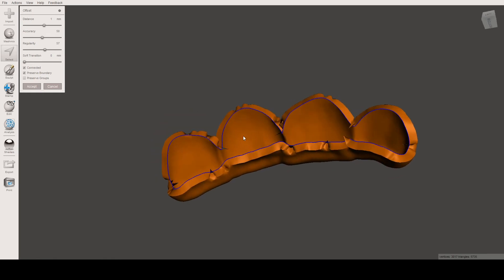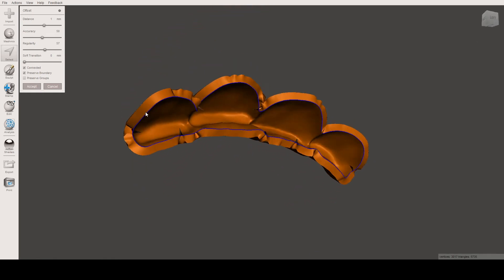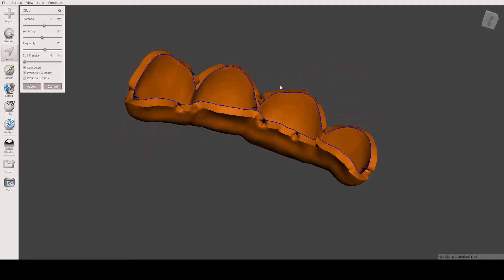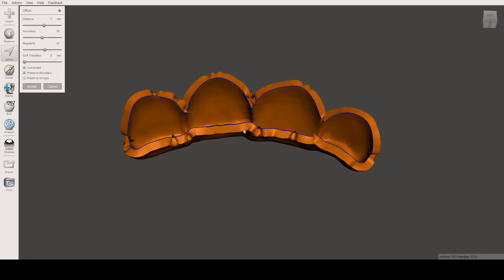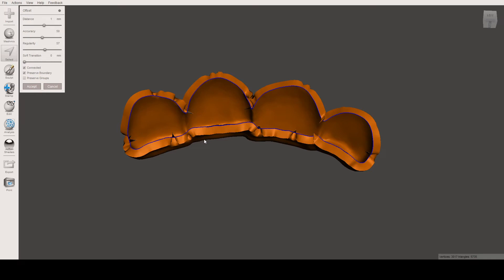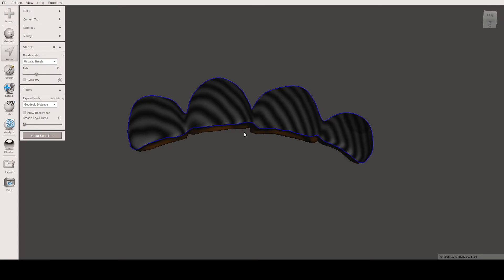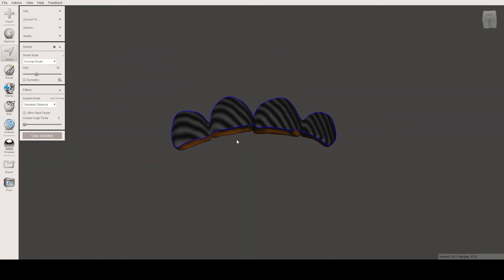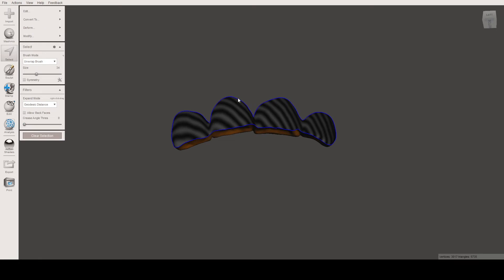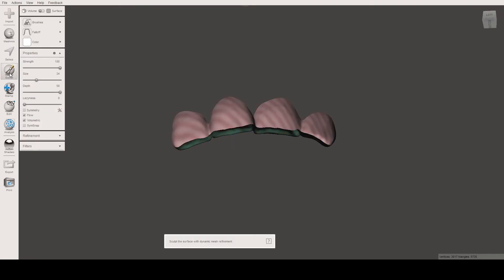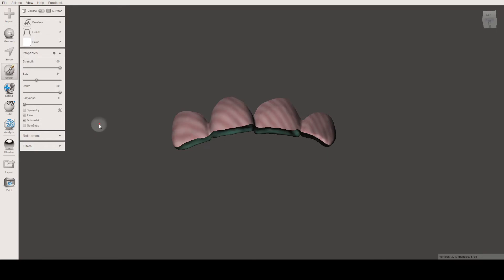You can see clearly that the borders are not smooth or regular. I found a very easy way to fix this problem. Let's press Ctrl+Z to undo and cancel the offset. The way to prevent these spikes or irregularities is to use the sculpt tools and a brush called Reduce.